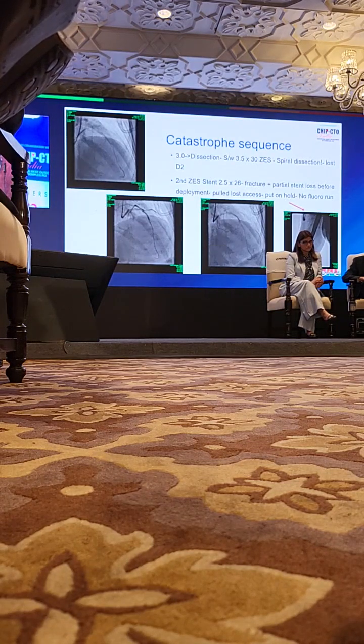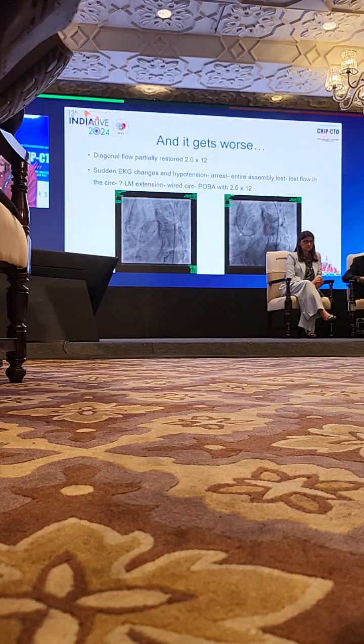in this case. What happened was when we tried to put a second stent in to plaster the distal dissection in, the stent just a few millimeters beyond the guide would not go in, and after a point fractured. And we tried to pull it back a little bit, and then we were trying to handle that situation. But immediately after, patient went into bradycardia, arrest, CPR, and then we lost all access over there. The stent is hanging in the axillary artery with the guide over there.